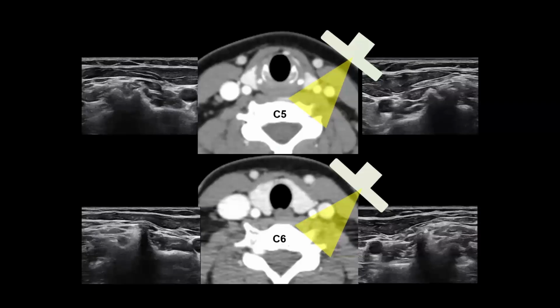This patient had a neck CT 2 years ago. When you compare the CT image with the US, the lesion can be confirmed as the anterior tubercle of the C-spine. On US, the most commonly mistaken part of the C-spine is the 6th anterior tubercle, because it is the most prominent. In this case, the right C6 anterior tubercle is more prominent than the left. In C5, you can also see the transverse process. You can see the brachial plexus between the anterior and posterior tubercles.